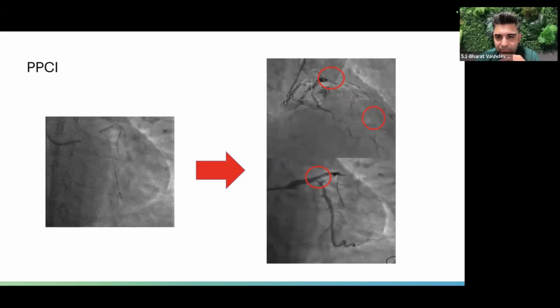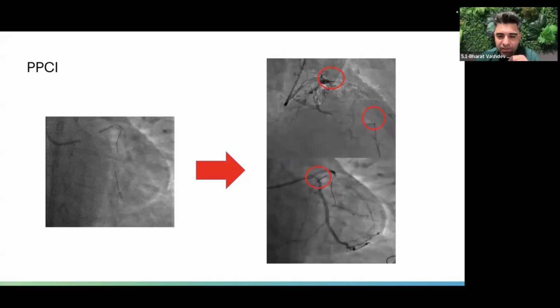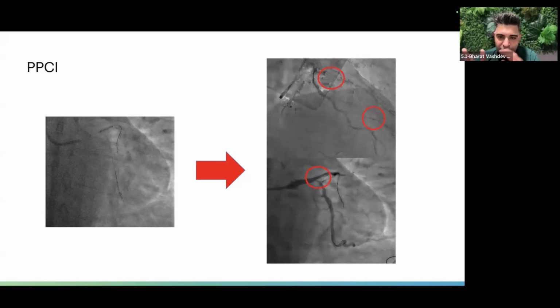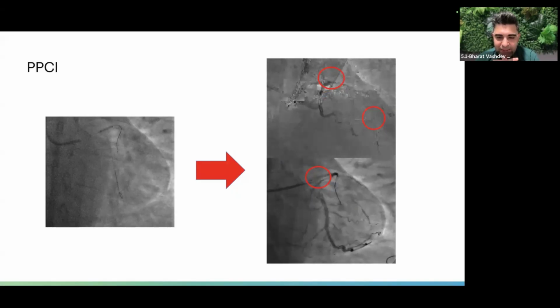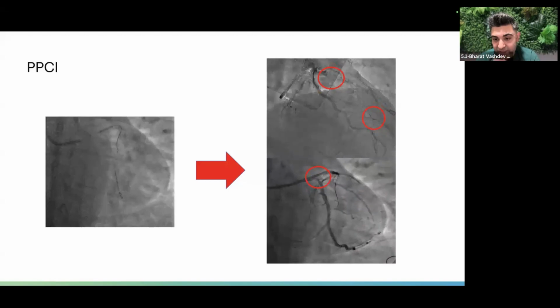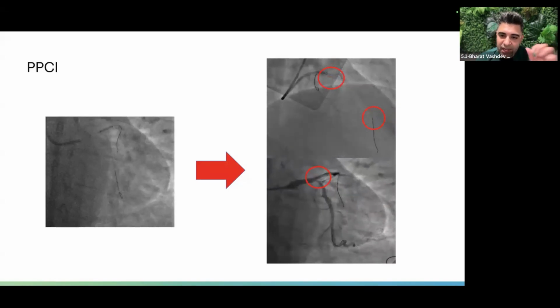There is a lesion in the mid to distal LAD. The original lesion, we have POBA'd it. And then you've got this ostial proximal circumflex lesion where, if you're going to stent across that, what's going to happen? Is that going to pinch a bit more? What's going to happen to it? It's a very big circumflex OM system. And we know he hasn't got a right coronary artery. So it's an important territory.